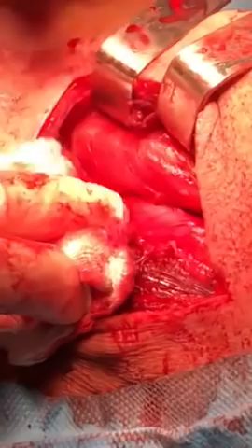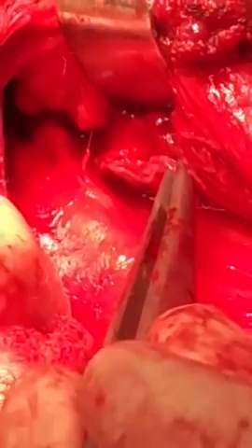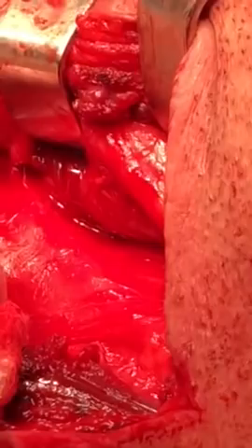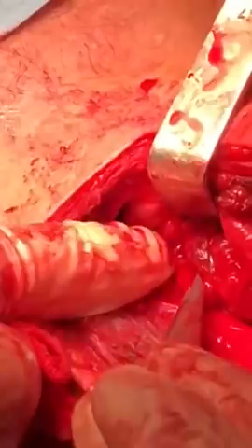A drain will be placed. The stapler line is flush with the esophagus. Taking more than this causes stenosis of the esophagus inlet, which would be a catastrophe. It is very important to confirm that the myotomy has been done properly for several centimeters — there is only mucosa, no muscles. Myotomy has been done. After this section, myotomy can be done easily. This is the best approach for these big cases.